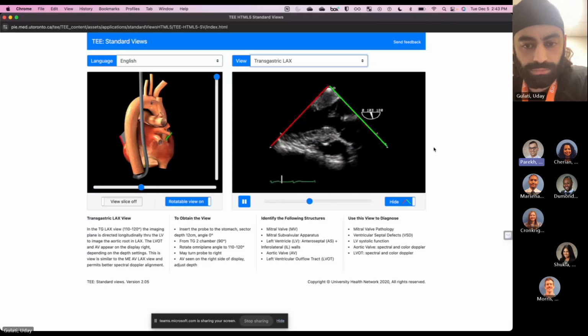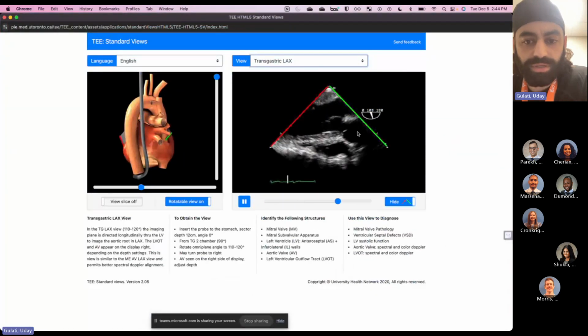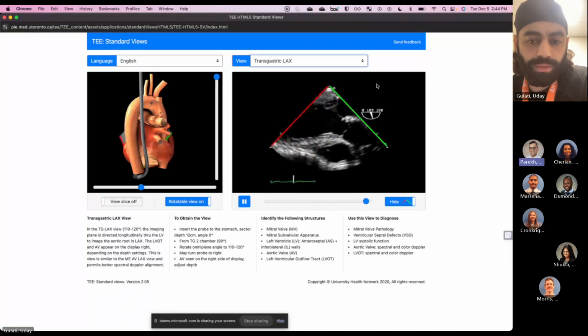We always measure it below that line on the ultrasound. I'm assuming in this one you measure above the line, or is it the same sort of waveform you're going to get for the VTI? It's the same, because the flow is going away from the probe. Your flow out of the LVOT VTI is going to be going away from the probe. Oh, I see it. Okay.